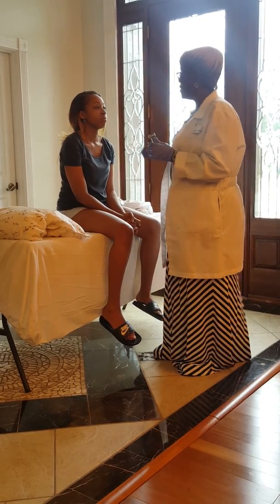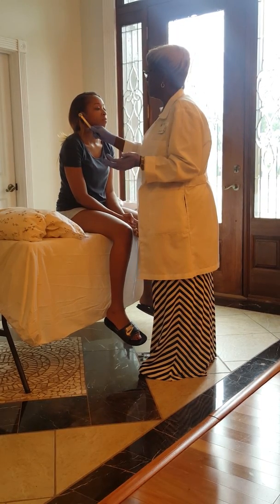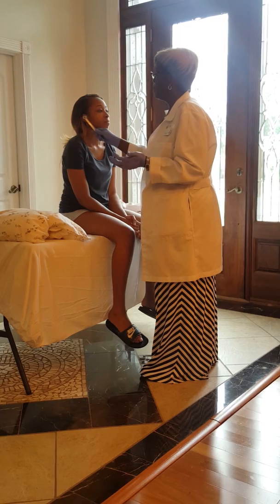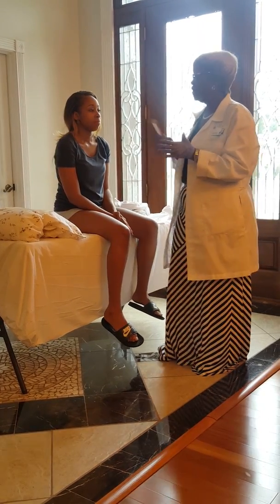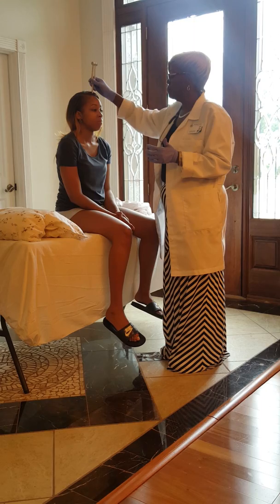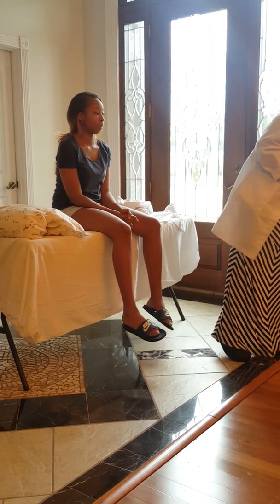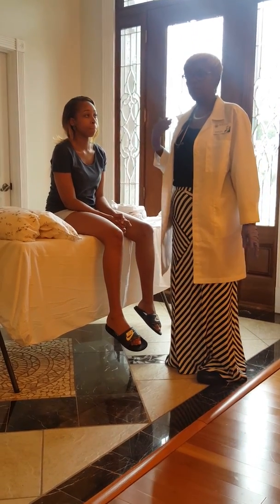Okay, so we checked the left ear, now we're gonna check the right. Okay, and now we're gonna check it on the forehead. Okay, and the next thing we're gonna do is we're gonna check her hearing with the whispered word.